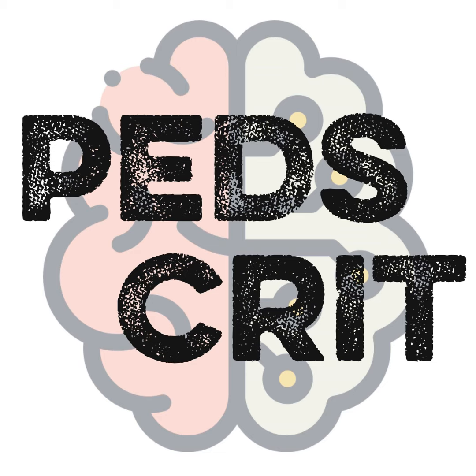Having said that, many pediatric centers, especially those centers who have offered liver transplantation, should make this available. I truly believe that we have enough evidence in adults in acute liver failure to extrapolate to our older teenager population to say CRRT with high volume plasma exchange should be considered in patients close to adults in terms of age and adult patients. That requires a dedicated group of nurses who can actually do plasma exchange.